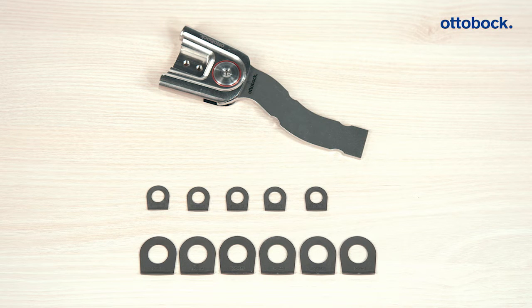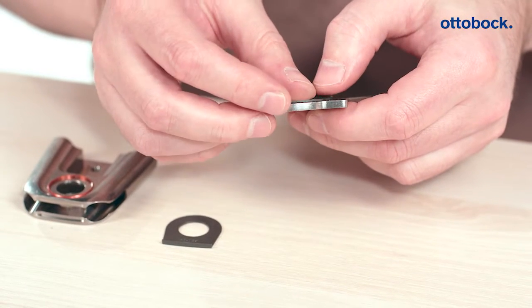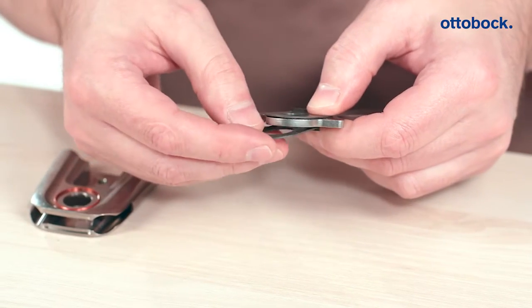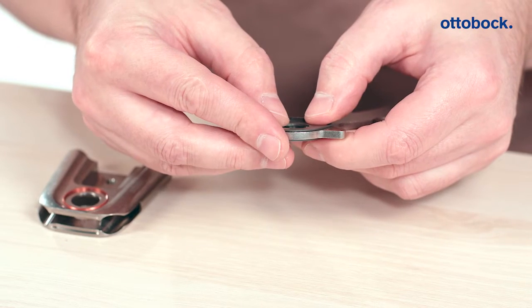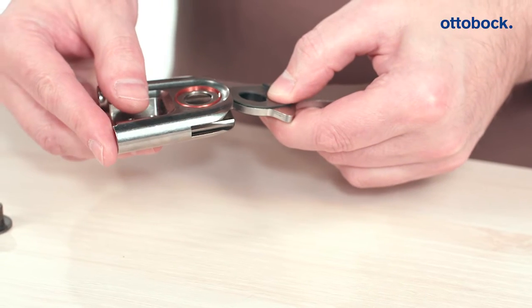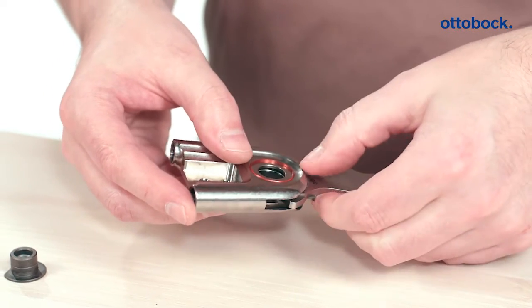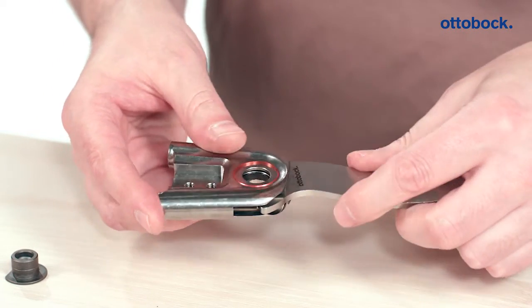For sizes 10 and 12, we recommend starting with two axial washers with a strength of 0.8 millimeters. For sizes 14, 16, and 20, one millimeter. Simply position the two axial washers on the respective sides of the foot stirrup. The mechanical stop of the axial washer faces away from the foot stirrup. Then slide the axial washers together with the foot stirrup into the joint.